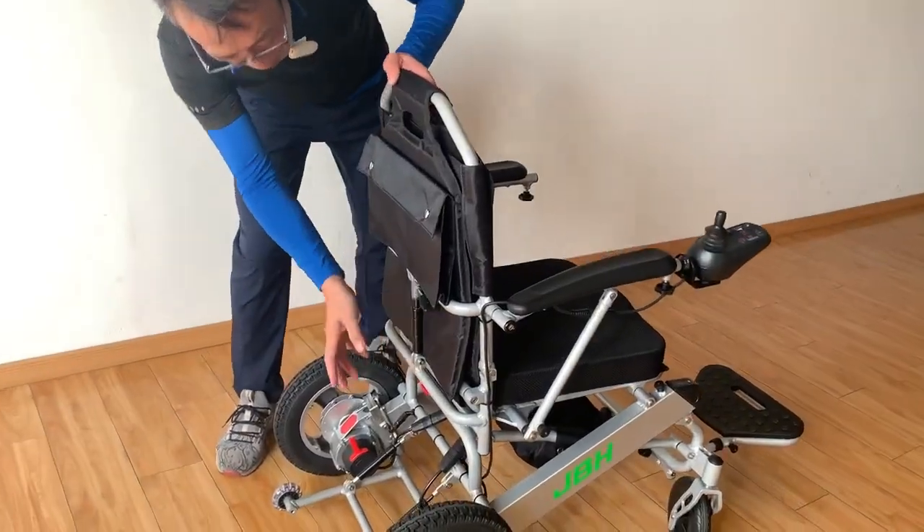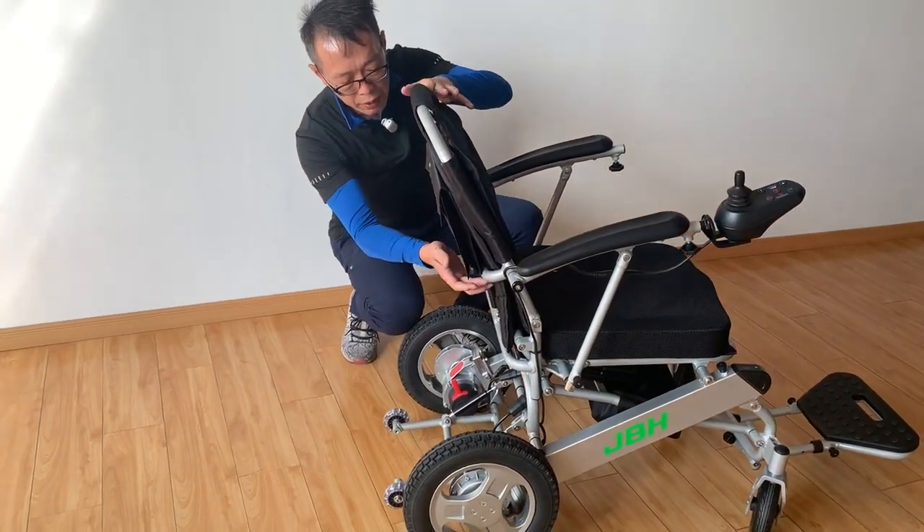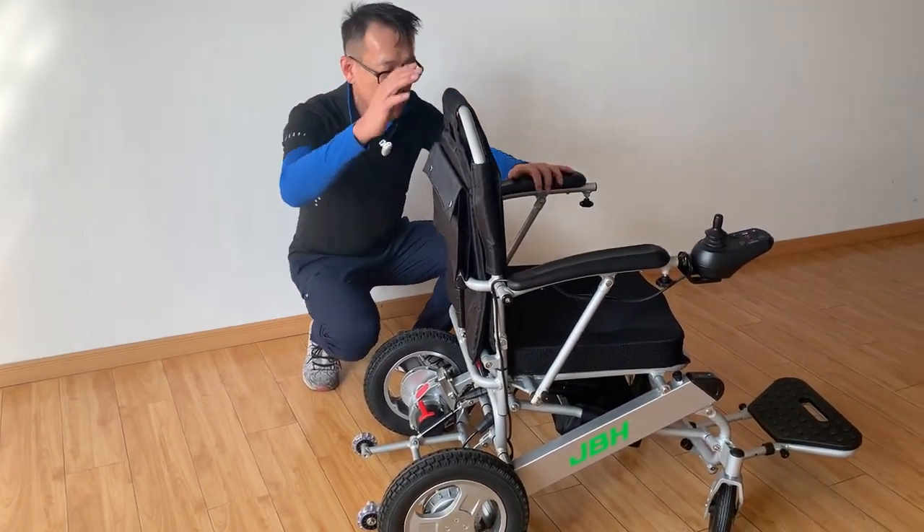The second one, you can see from here we have a gas lift design — you can stop everywhere, or you can have a one-stop switch of the backrest angle.